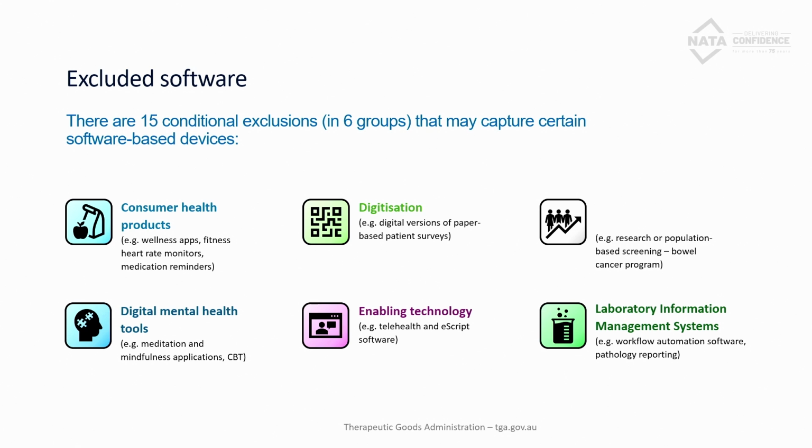that wouldn't be excluded. Digital health tools are also excluded, provided they're based on established clinical practice guidelines that are referenced and displayed in the software. And those products, so we're talking about things like cognitive behaviour tools, the regulatory oversight for those is provided by the Australian Commission for Safety and Quality of Healthcare. They have a set of voluntary accreditation standards. We've also got enabling technology, such as telehealth software that's excluded, or digitisation of paper-based records, which might previously have been in a physical paper-based form.